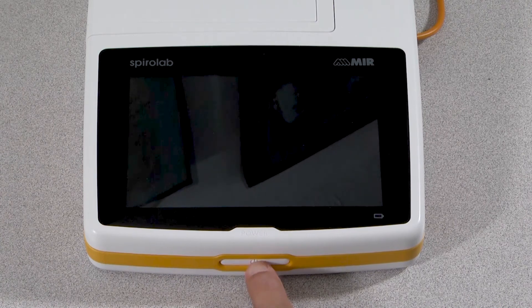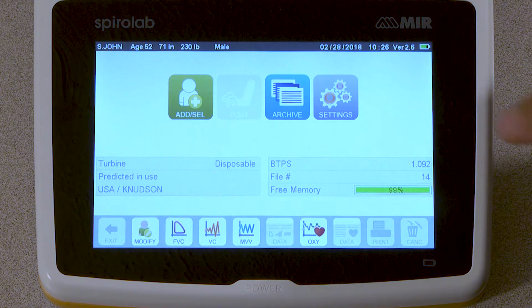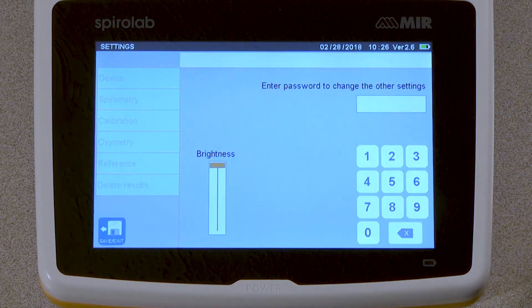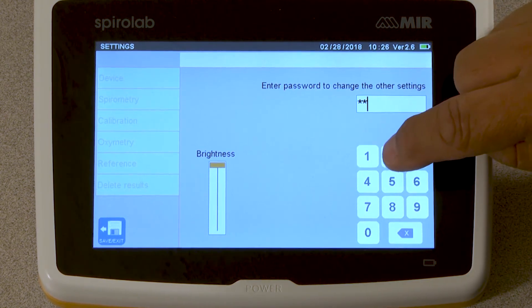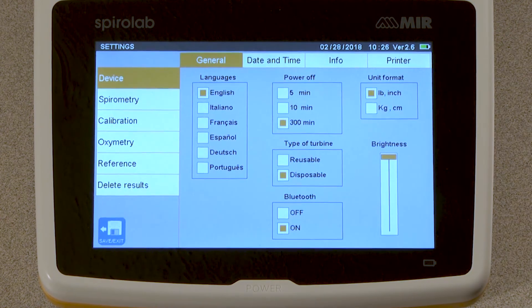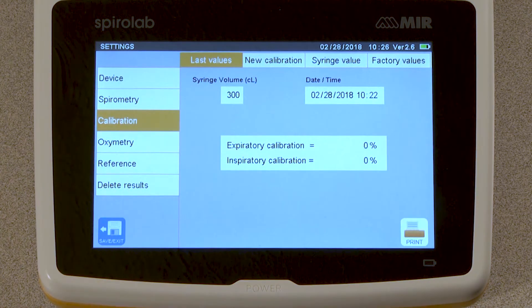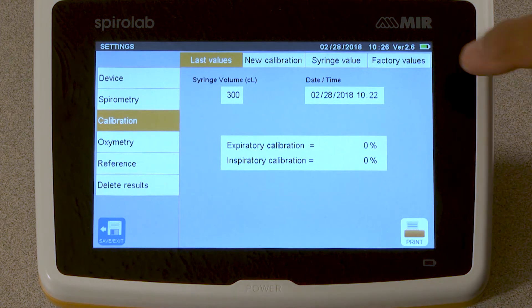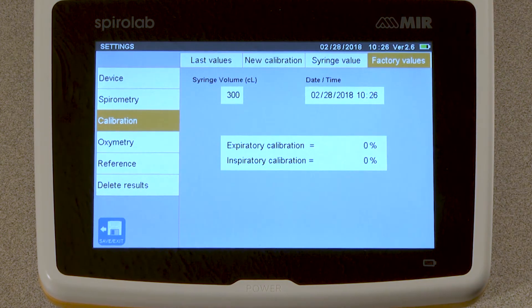Turn on the SpiroLab, and at the home screen, select Settings. Tap the box to enter the setting password. The password to enter settings is 1-2-2-3-3-3. Select Calibration from the list at the left side of the screen. This will take you to the calibration menu.